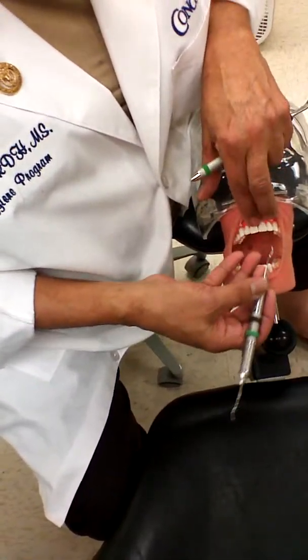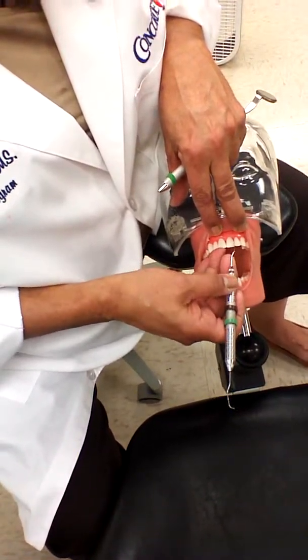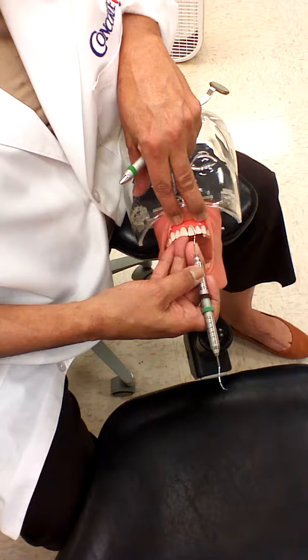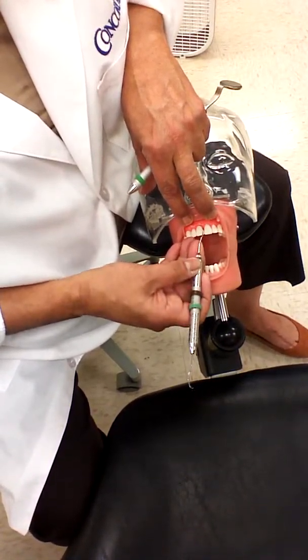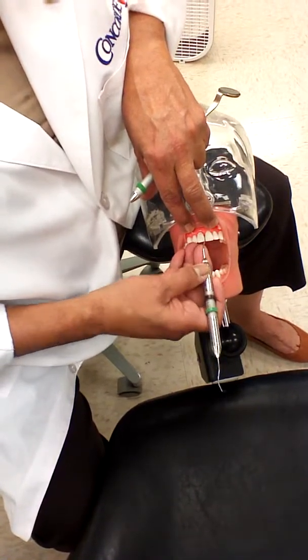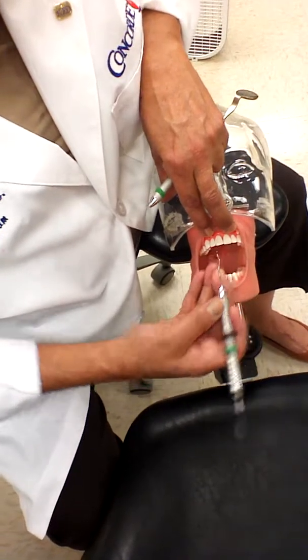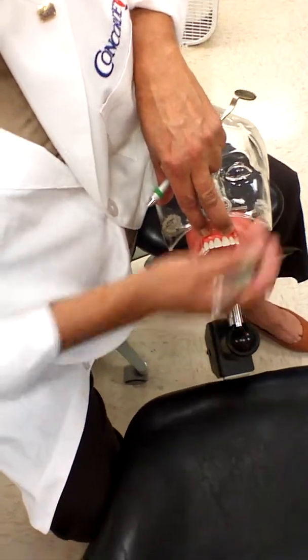That's why in your skill criteria, it says that you stop, like for 3 seconds, because that's supposed to give you time to evaluate what you're doing. Of course, in real life, you really don't stop that much. You just keep it going, but as a student, it's an effort for you to say, is my hand still doing what it needs to be doing? Is it moving? Are my fingers? Am I rolling? Am I adapted? Am I pivoting? All those things that are crucial to making this work.